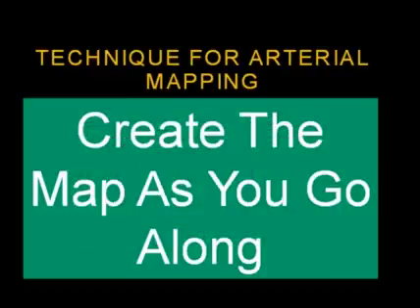Very important is to create the arterial map as you go along. This is not the kind of study that can be easily reproduced at the end of a day after you scan 10 or 12 patients or so. There are just too many details to recreate at the end of the day. And so what we do is we create the map segmentally. As we evaluate the aorta to the aortic bifurcation, we would then go and create that map, evaluate the iliacs and create the map of the iliacs, then go on to the femoral popliteal segment, and then onto the tibial artery, scanning one tibial artery at a time and creating the map as we go along.